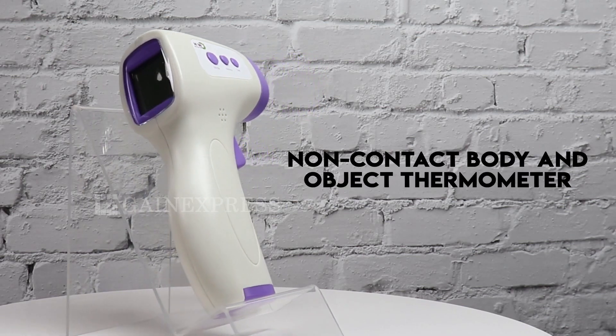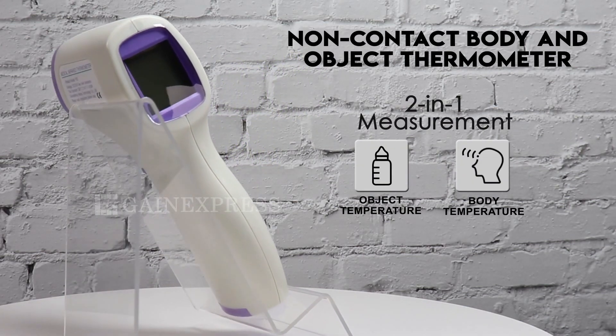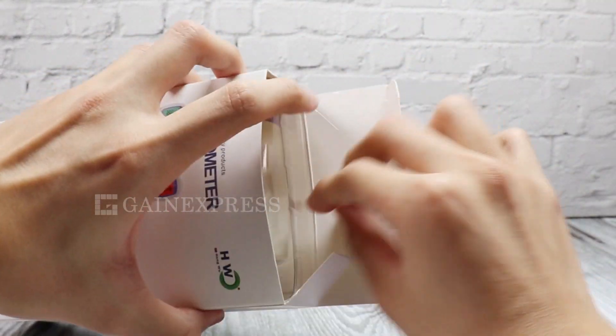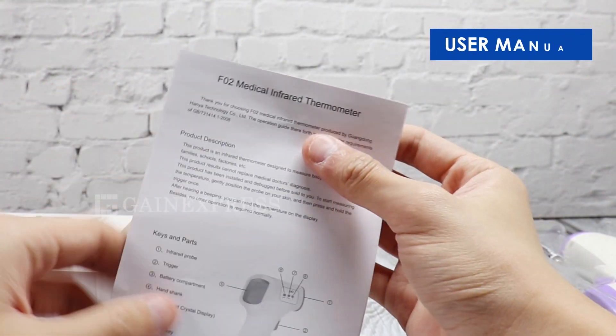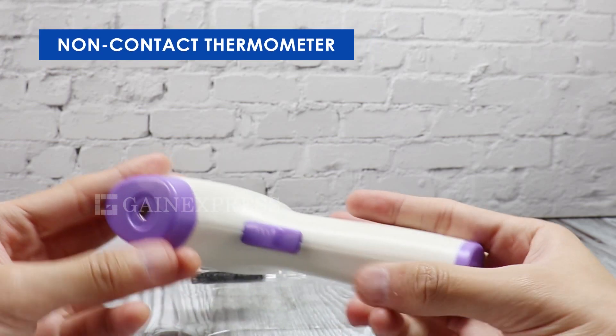This infrared thermometer is designed to measure body and object temperature. The set includes a user manual and the non-contact thermometer.